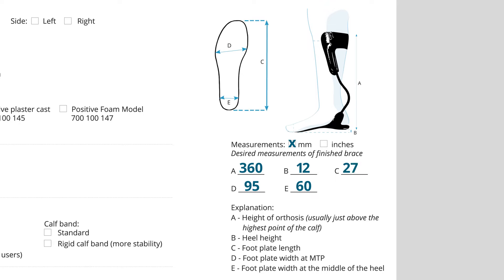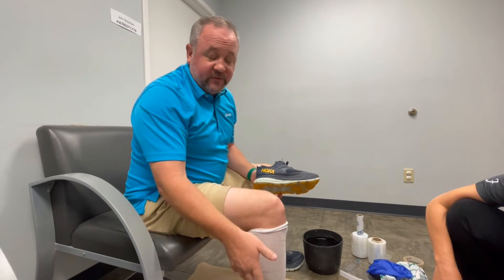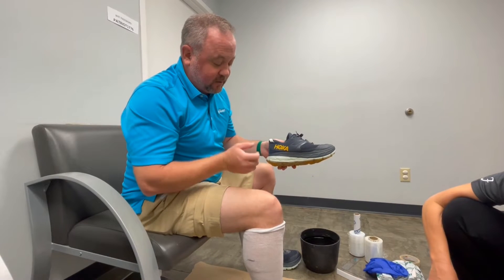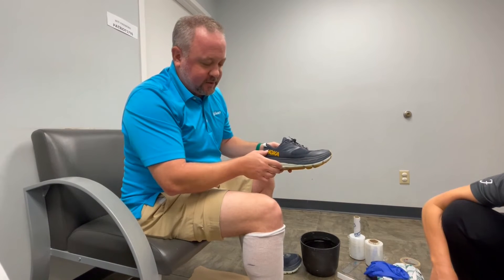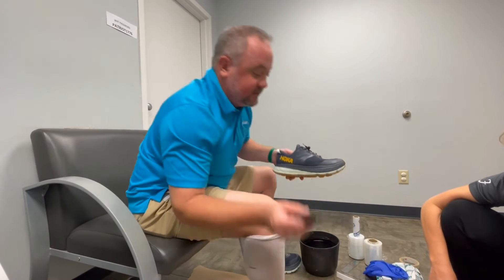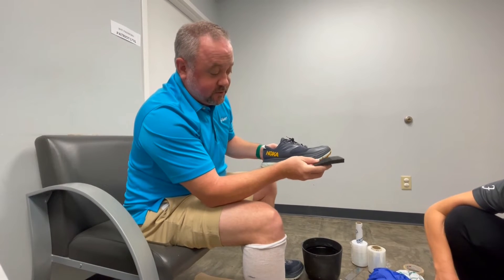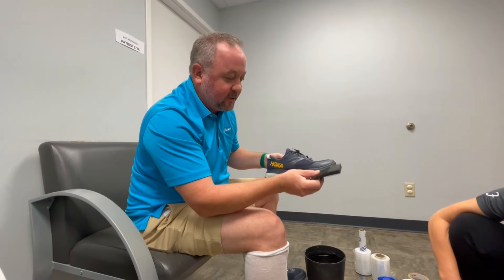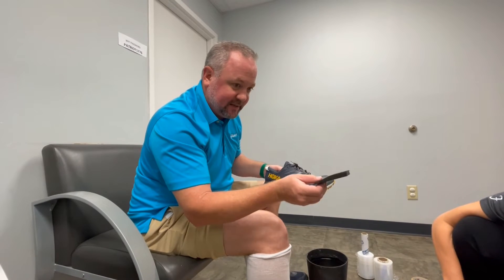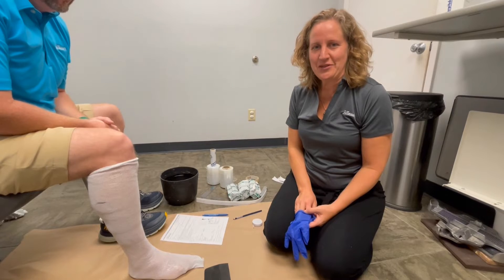Jenny is going to use a half-inch or 12 millimeter heel wedge because that matches the shoe, which has a thick heel with a big drop down to the toe. She's also going to use a wedge at the toe because the shoe curves up — it's not straight — so a small toe wedge accommodates that rollover. This helps the foot plate portion of the brace last longer. These two wedges go underneath the foot to get a better cast.